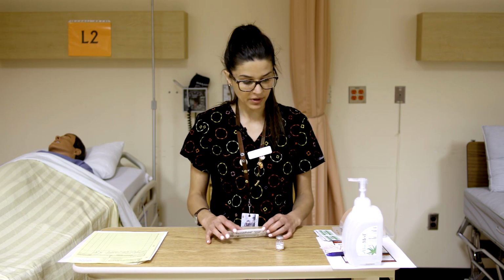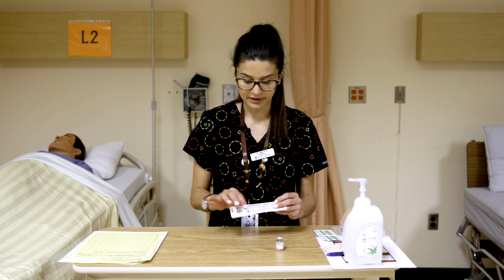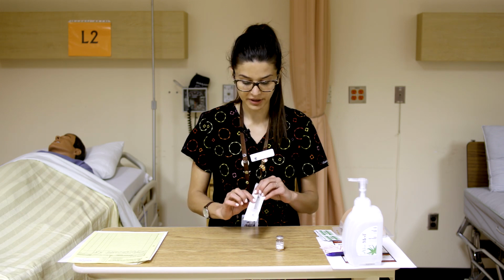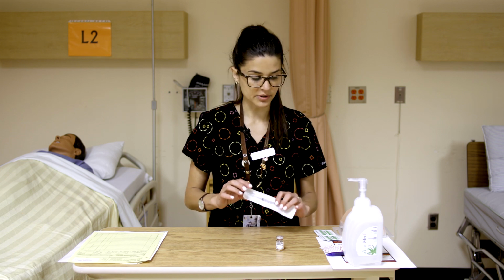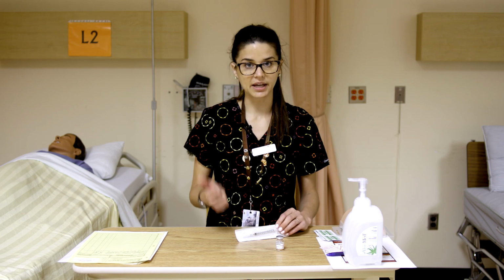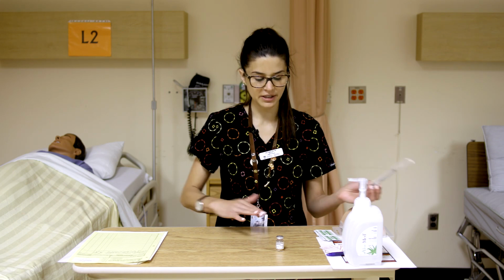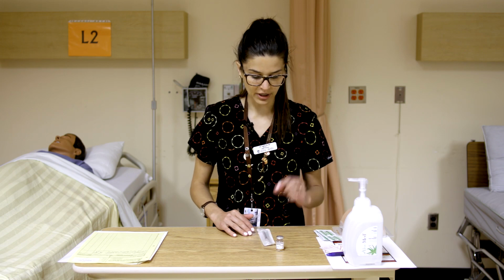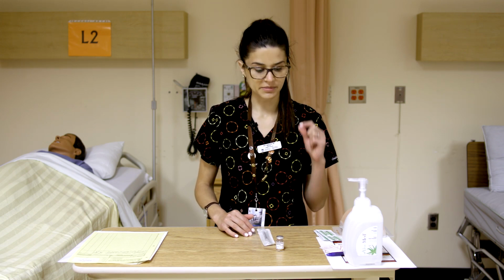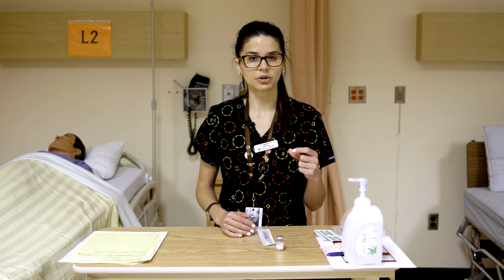So what we want to do is pick the correct syringe with the correct volume markings on it and size. We also want to pick the correct injection needle, so the correct gauge and length. And I think, as you can imagine, intradermally it's going pretty narrowly into the dermis, so we're actually going to want to pick a very small sliver gauge almost of a needle, and quite a short length.